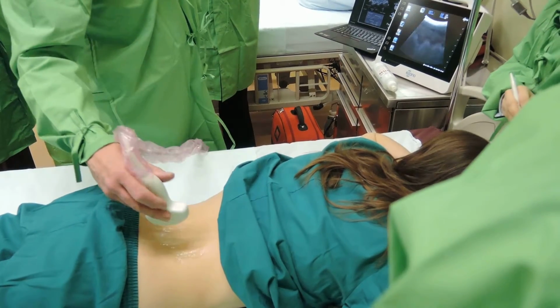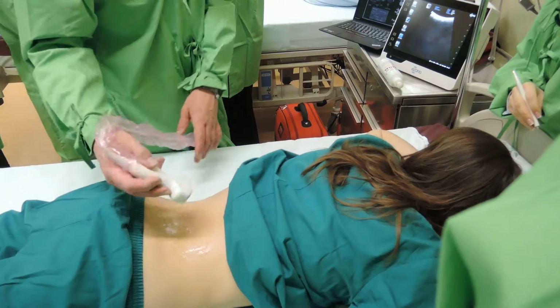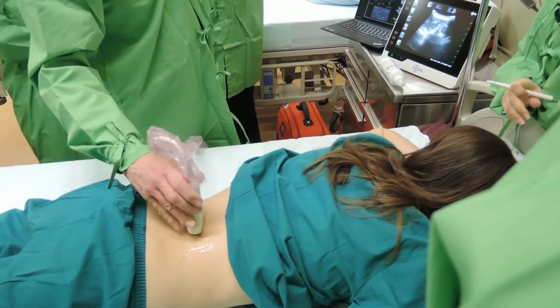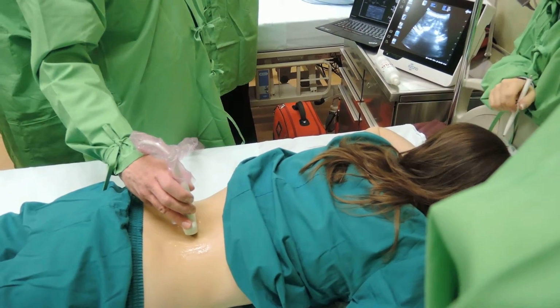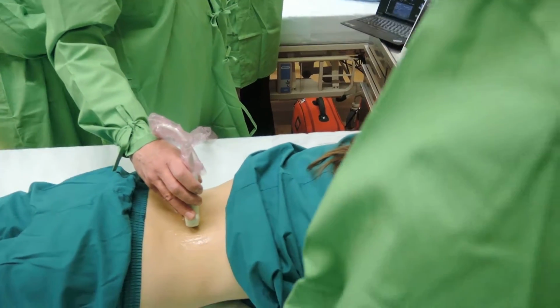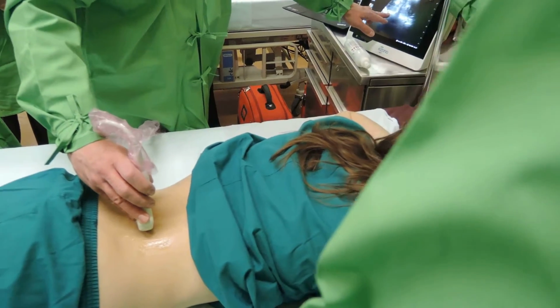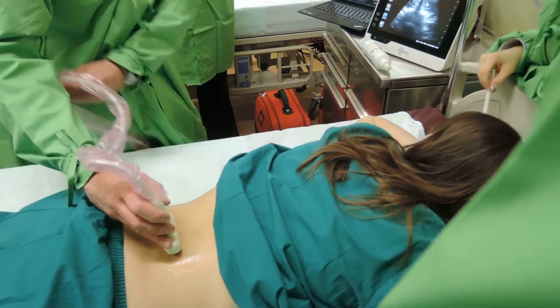All right. And the next view is a transverse view. The next view will be along the short axis, the transverse one. Here there is a spinous process, and then the laminae appear, the plates of the vertebral arches, bright and white.